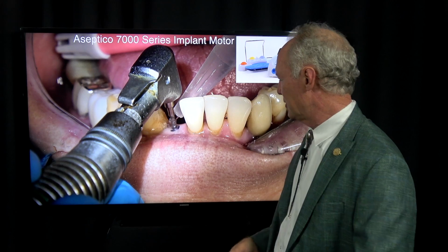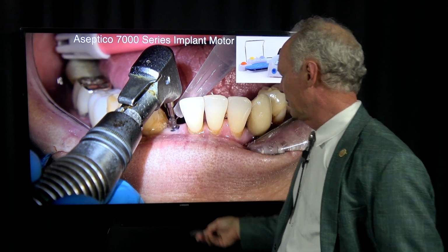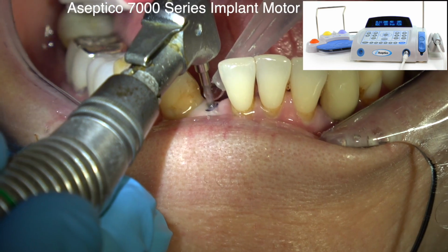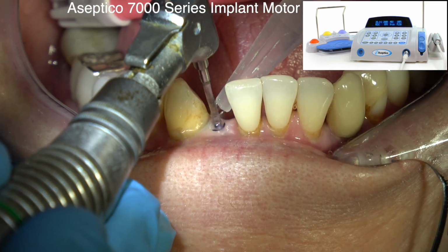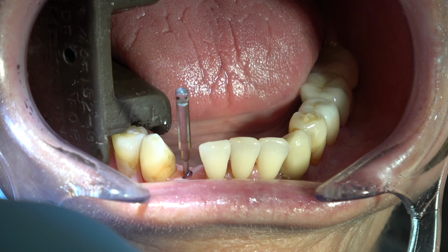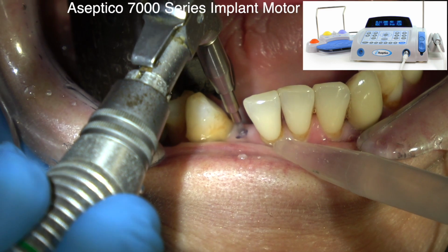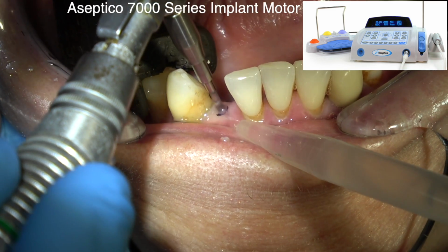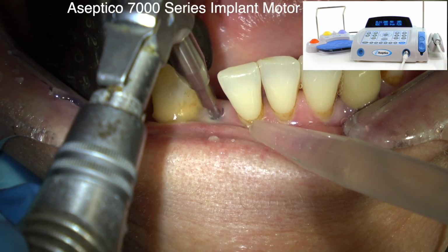So I want to create a channel for that implant to go into, so this pilot drill will be significantly smaller in diameter than the small diameter implant, so it'll just guide it into the osteotomy that I've created with the pilot drill. I'm looking at it from both sides. See, this is 16 millimeters or 17 millimeters. I'm just sure I've got it in the right direction. Then I'm going to take a radiograph of that.